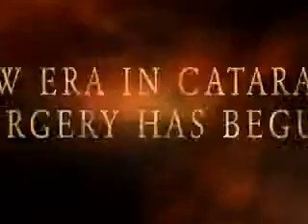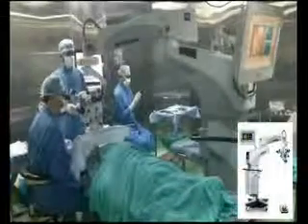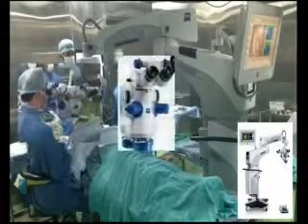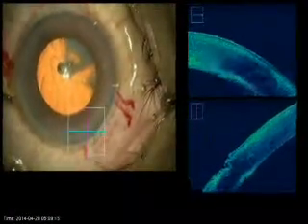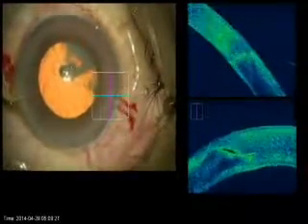A new era in cataract surgery has begun, with the advent of this new technology, which is bound to reinforce some concepts and shatter some. We present our experience with Rescan 700 in cataract surgery, which is an operating microscope integrated real-time spectral domain OCT with a resolution of 5 microns. The area of interest can be brought into focus by changing cube position and size.